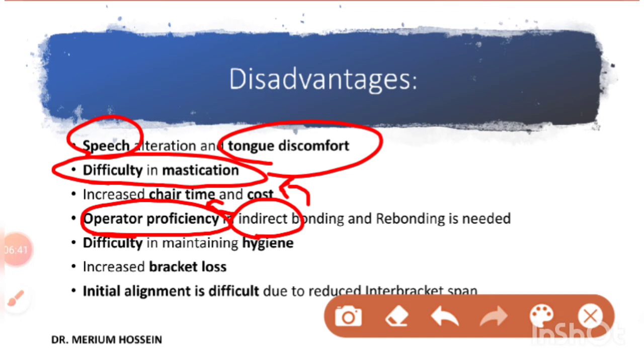So now talking about the next one, there is also going to be difficulty in maintaining hygiene, as the patient cannot properly see the braces on the lingual surfaces, so he doesn't know in which areas there is food impaction. As a result, the patient is not able to focus on hygiene maintenance on the lingual surfaces.